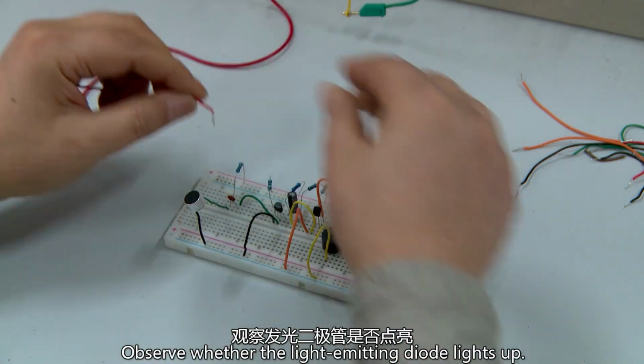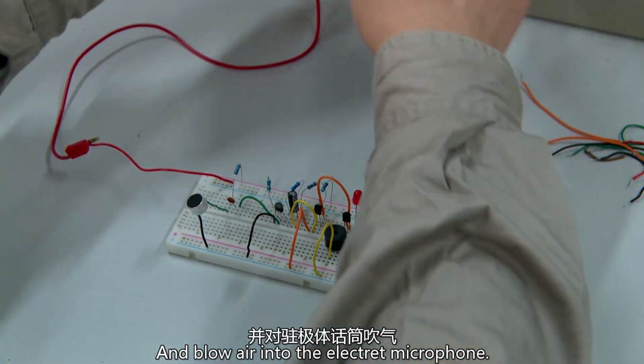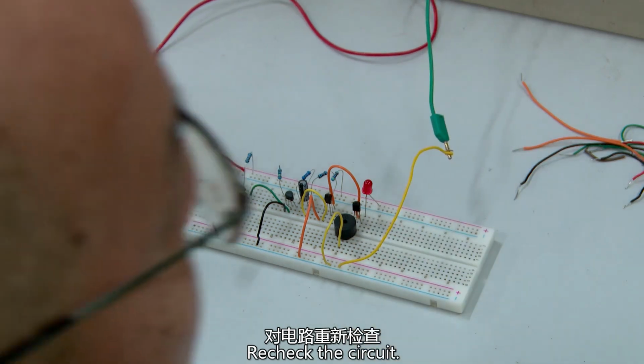Observe whether the light-emitting diode lights up, and blow air into the electric microphone. Listen to see if the speaker makes a sound. If it is not normal, cut off the power. Recheck the circuit.